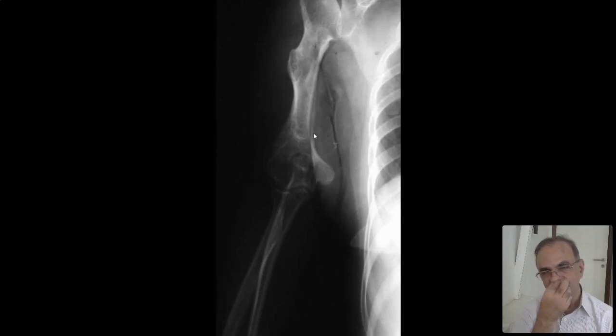The Erlenmeyer flask deformity is the opposite of that. When there is no normal tubulation, the bone looks straight, parallel, vastly more parallel than normal. You know that it's a skeletal dysplasia, right? You keep looking at bones and a few skeletal dysplasias, and you look at that and you know. Normal tubulation of the bone is lost near the distal metaphysis.